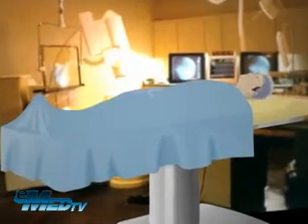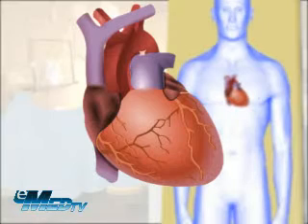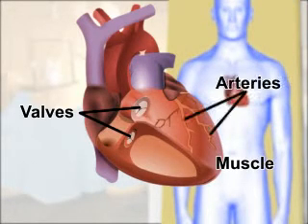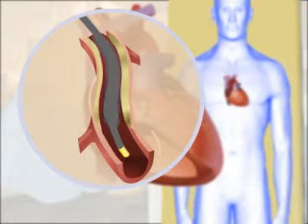Cardiac catheterization with angioplasty is a procedure that allows the doctor to study the condition of your heart, including the muscle, valves, and arteries. It can also be used to open blocked coronary arteries and improve blood and oxygen flow to the heart without surgery.